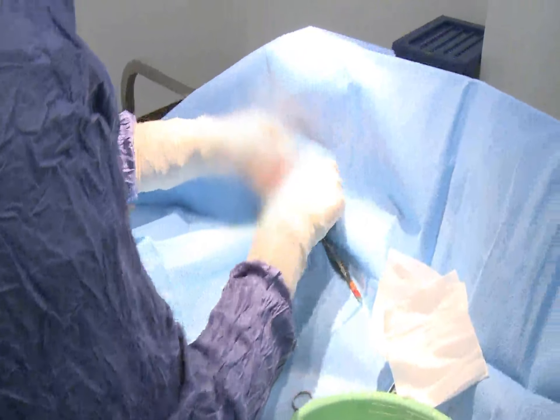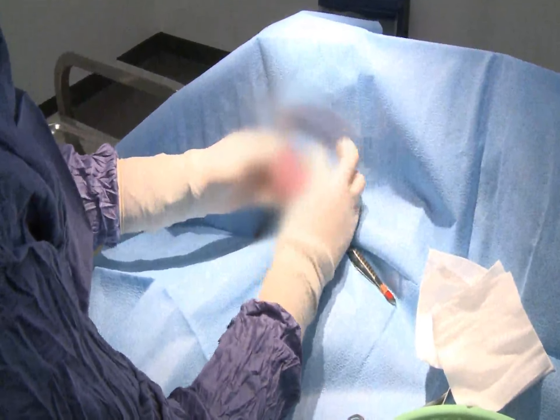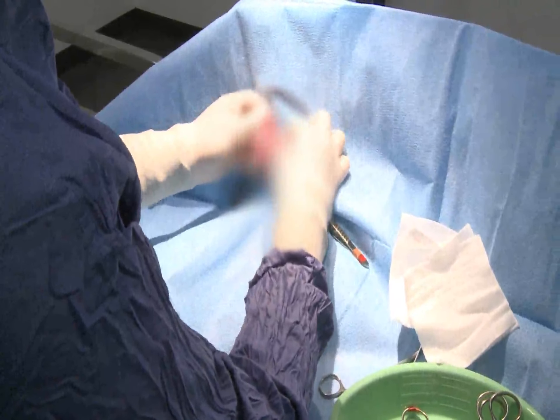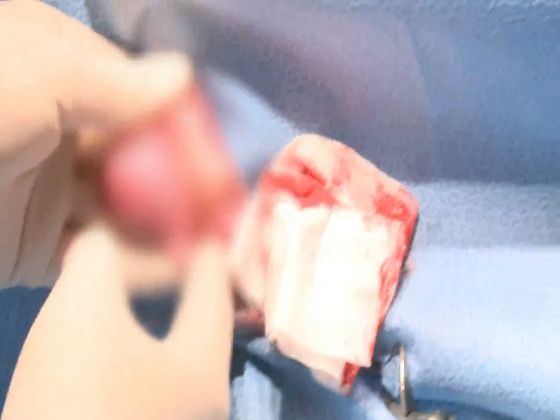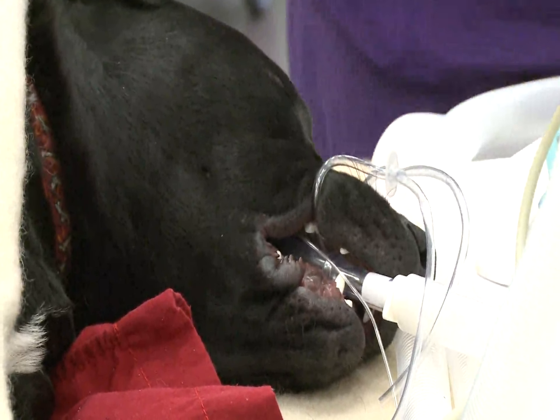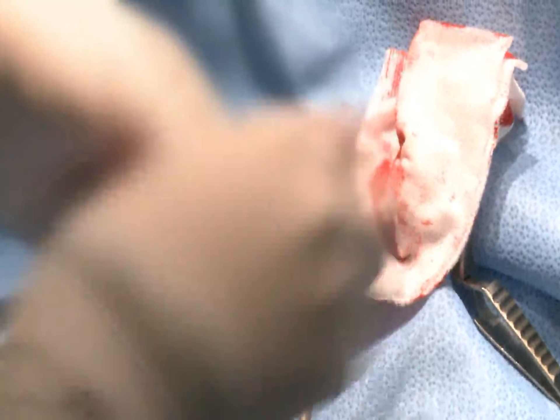There is his testicle there. This is all the blood vessels here, and that's the spermatic cord that wraps its way around there and runs down there. This bit here is just a little bit of tissue from the testicular sac. What we're going to do is break that attachment — we just use some forceps to do that. It's quite brutal, I'm afraid. We literally do just pull it off the end, and it comes away nicely. And then we're just left with our blood vessels and our spermatic cord.